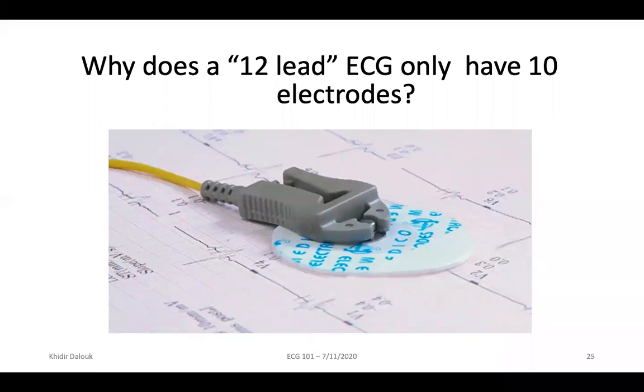You can use phone apps. They might help you. There are even EP apps that can help us in EP to do different kinds of things. But I think in order for you to learn how to read an ECG, you should do it yourself. You should not get the app to read it for you. These are programs that can help. Now artificial intelligence is being used in everything, but I think you should read your ECG yourself, because the ECG that you're going to be using in your emergency room or in your hospital is something that you can read.